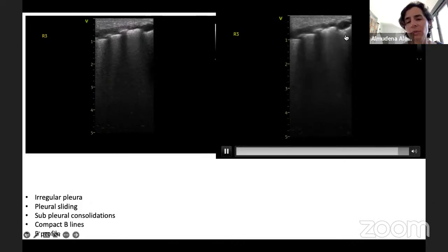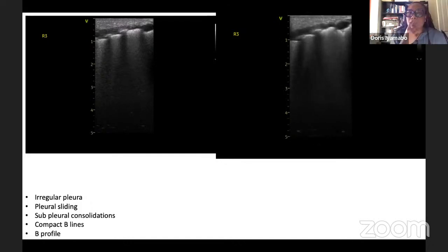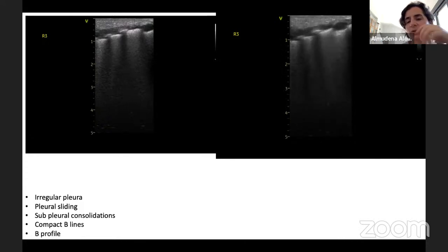This is normal due to the position. Probably the baby was in supine position. Well, this is not a clinically significant consolidation, just very small ones. That's what we call subpleural consolidation, although as Nadia Youssef told you a few weeks before, Dr. Daniel Lanchestein doesn't want us to use that term. Those are small atelectasis at the level of the pleural line, the concept that some people use to say subpleural consolidation. When you find a bigger one, that's when you call it extensive consolidation. Okay.